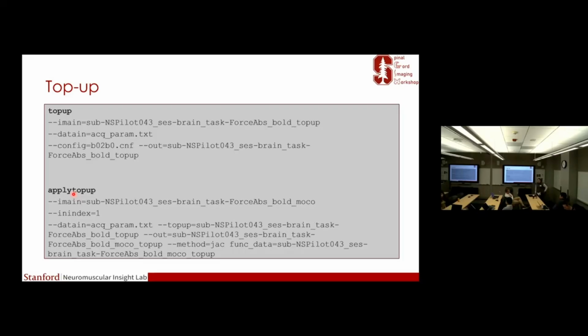It hasn't been validated so far for the spinal cord, and I don't know if you have tried. I didn't try, but as I said, a recent group has used it. I can refer you to that publication, and they got good results. We have the same images for the spinal cord too. I don't know if we have really tried doing topup or not. I can't remember whether I tried or not.